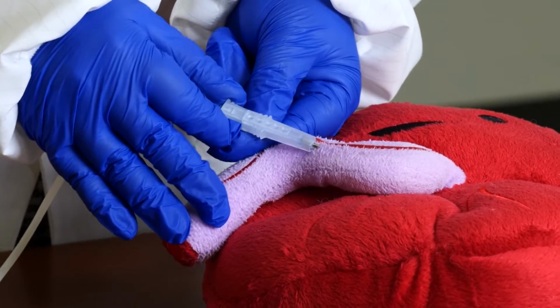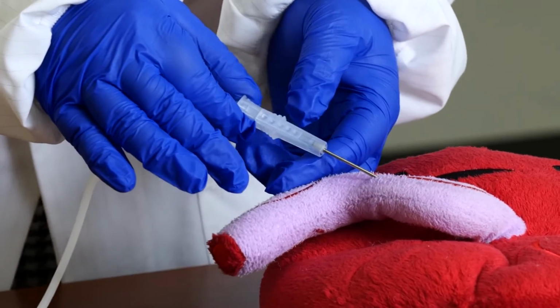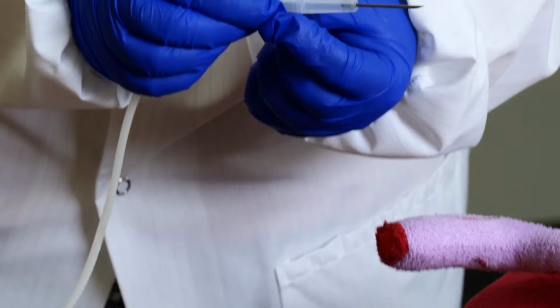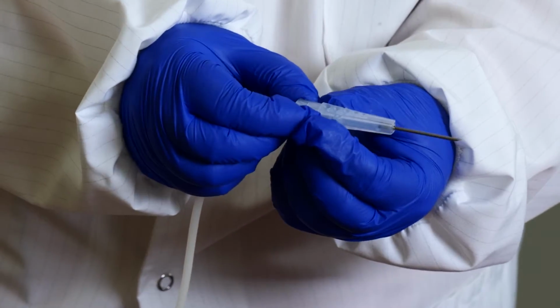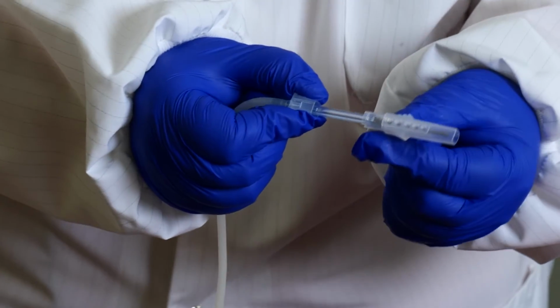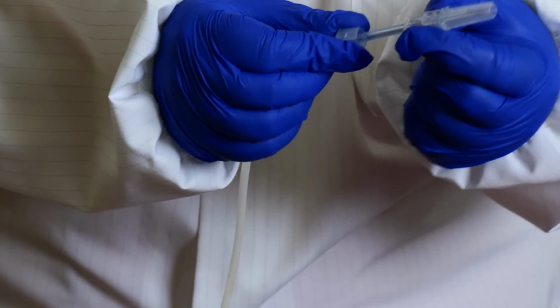The needle guard is attached to the needle, and when you're ready, you'll remove the needle from the umbilical cord, hold the needle guard cover at the base, and then slide. The needle guard will click when it has gone into place and will not be able to be moved.